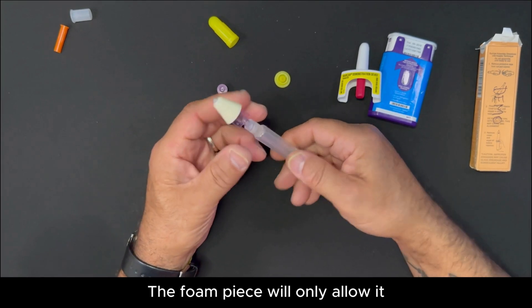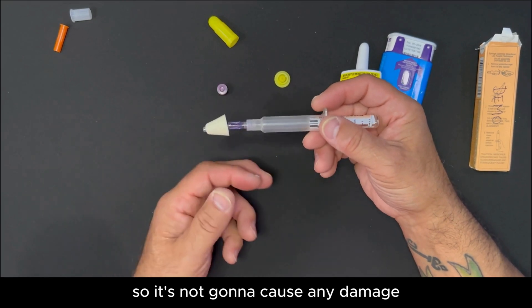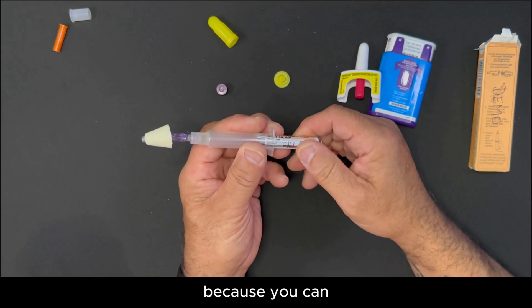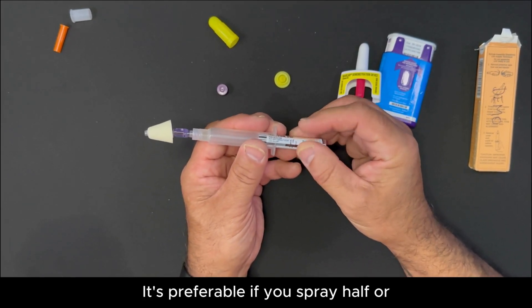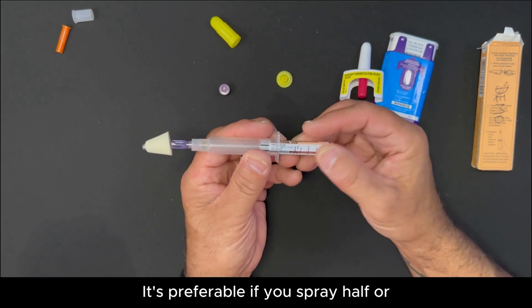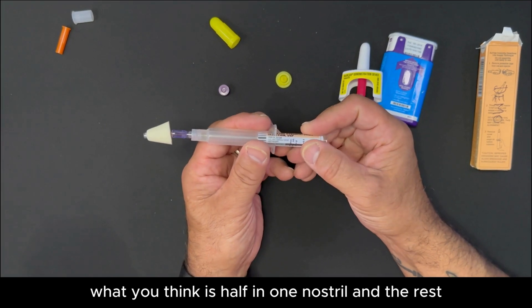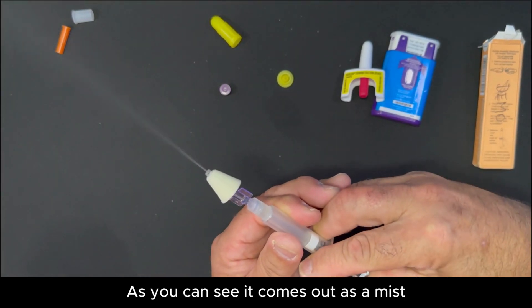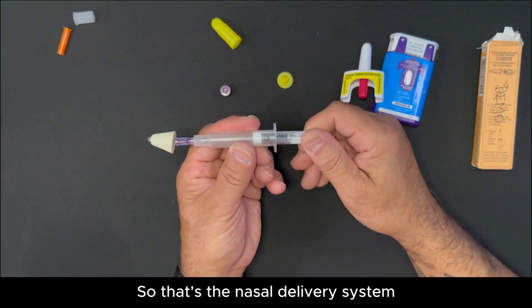The foam piece will only allow it to go so far in the nasal passage, so it's not going to cause any damage. Do it slowly because you can have control over how much comes out. It's preferable to spray half in one nostril and the rest in the other nostril. As you can see, it comes out as a mist — it's easy to control. That's the nasal delivery system.